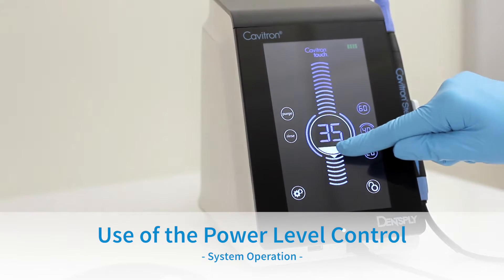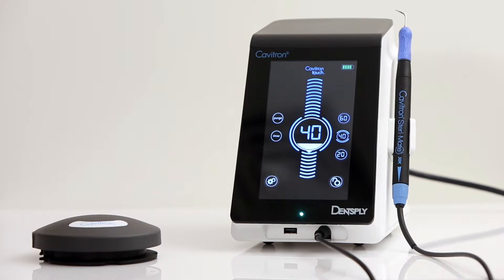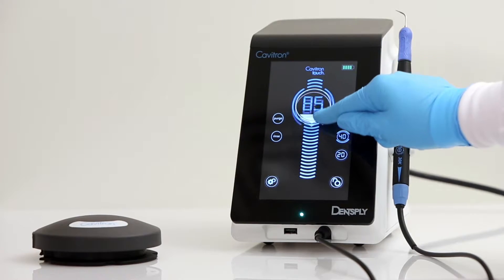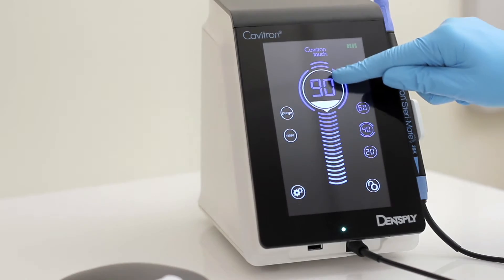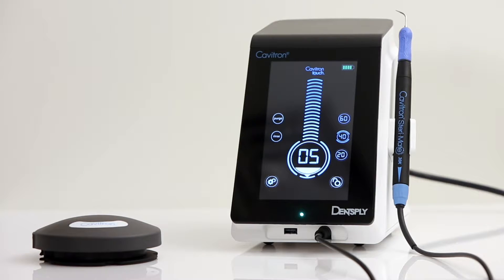Use of the Ultrasonic Power Level Control: To control the ultrasonic power level, simply slide to select your desired power level. Sliding up increases the distance the insert tip moves, while sliding down decreases the distance. A power level may also be selected by pressing the desired position on the power scale. The power range indicator fluctuates from 5% to 100%. Please note that there is not a visible blue zone; 5% to 35% is considered the blue zone range.